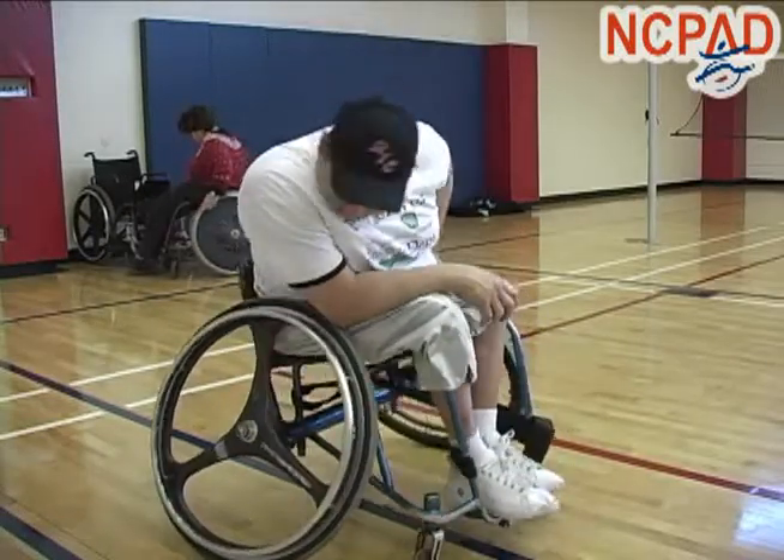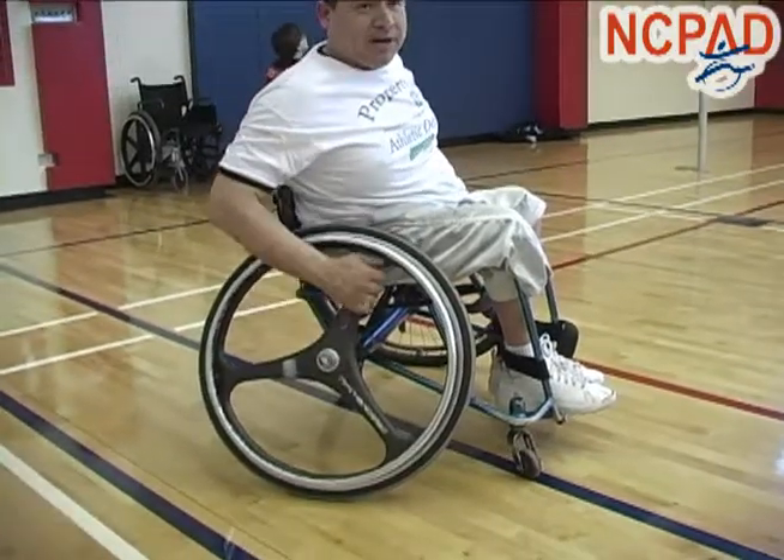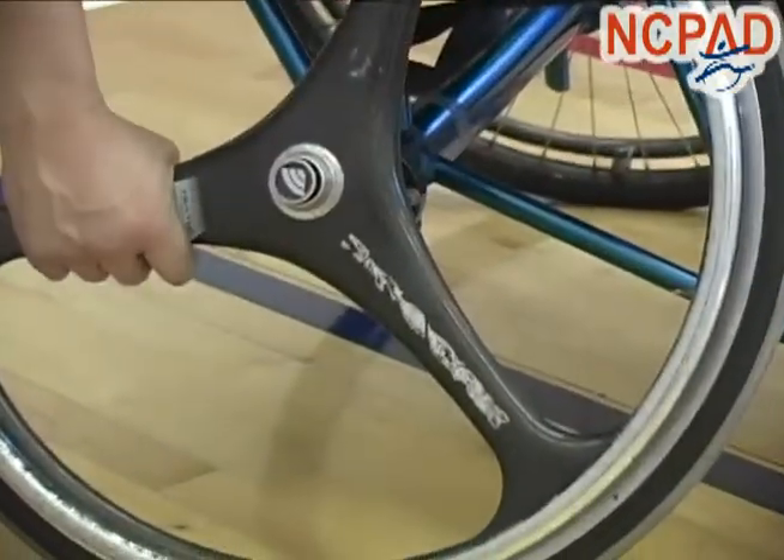This one is made out of carbon fiber. This rim alone is like $300. It's like a bike rim — a lot of bikes use this rim, the X-score.